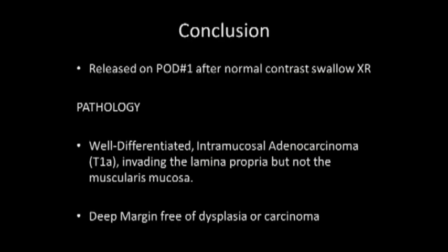Here you see the hemostatic submucosal layer, and the lesion has been completely excised. The patient did extremely well postoperatively. She had a normal contrast upper GI study. On final pathology, she was found to have invasive adenocarcinoma, but it was a T1A lesion invading into the lamina propria but not through and not into the muscularis. The deep margin was free, as were the lateral margins.